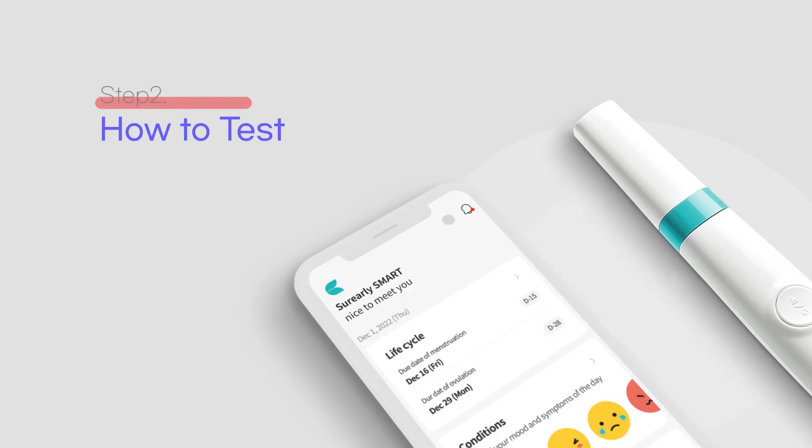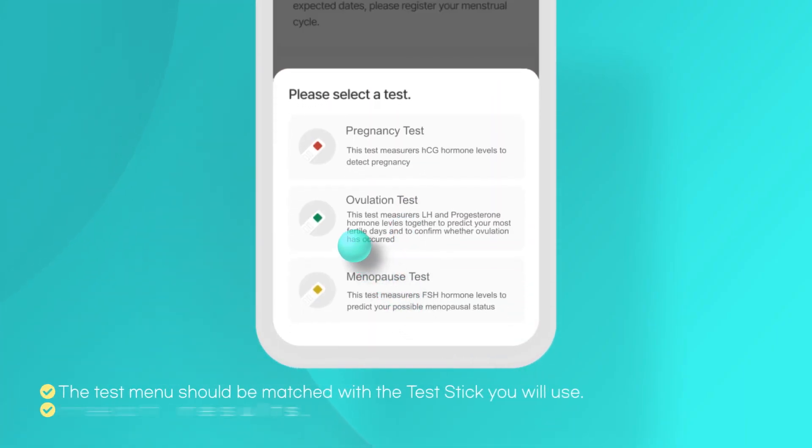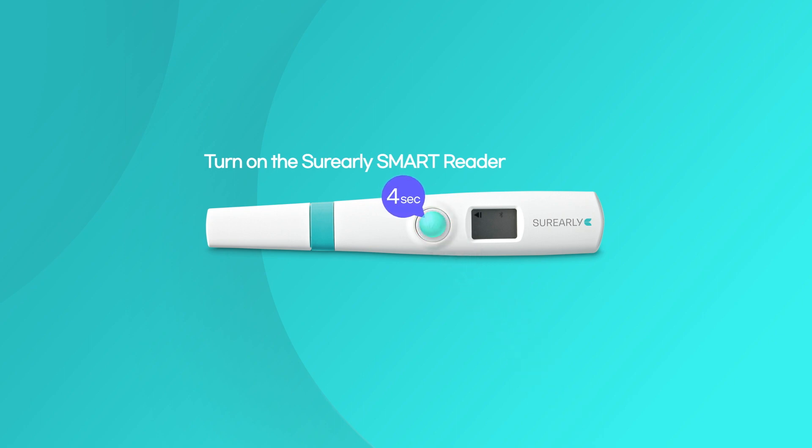Step 2, how to test. Select the correct test menu on the app and tap the start button. Before inserting the test stick, press and hold the power button for 5 seconds to turn on the test reader.